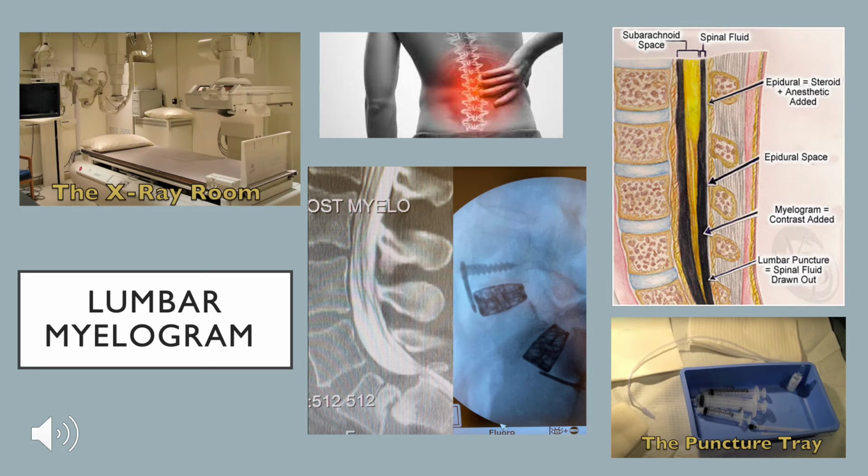Steps before the procedure. All patients are to be screened for any medical conditions and daily medications, in case some should be discontinued days prior. Most importantly, will the patient need to be pre-medicated due to previous allergic reaction?